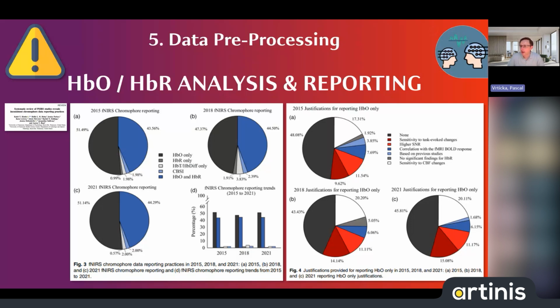And so I think, as I said before, the field is moving in the direction that we should always report both of them, at least the HBR data also in the supplement, and it's always nice to see the full analysis done with the HBR data. And quite often only some findings are in the HBO and not in the HBR.